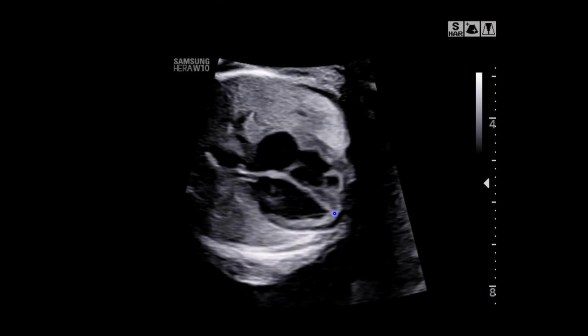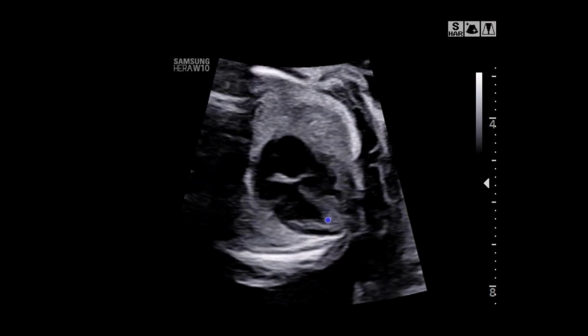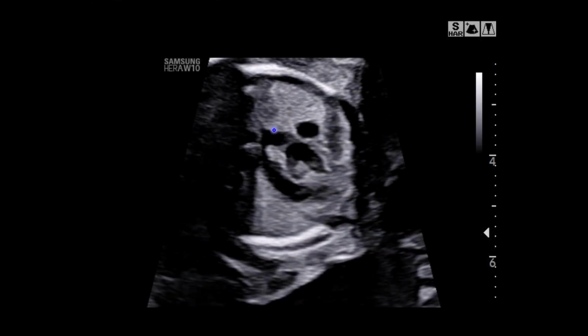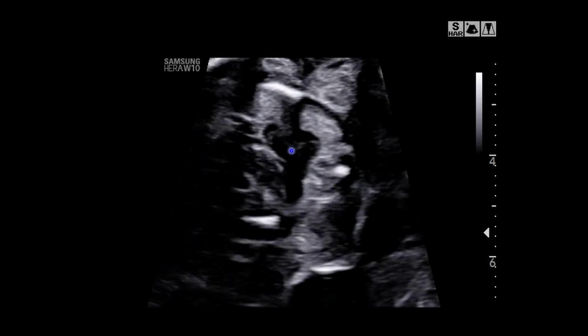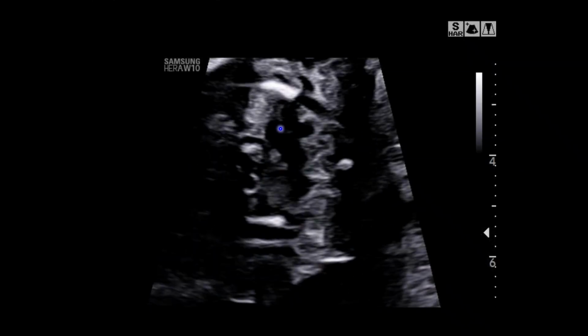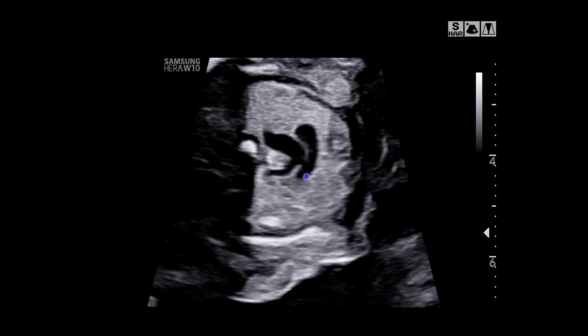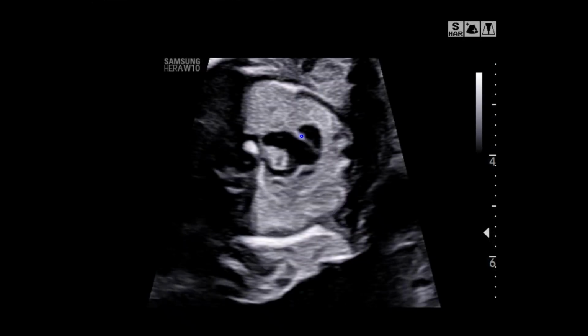Again, four-chamber view, this is a breech presenting fetus. And we can see that this is left and that's right over there. There's the innominate vein, and you're seeing this aorta is a right-sided aorta. So this is right over here. This is the right-sided SVC. The innominate vein is draining toward that right SVC and this upper chest.